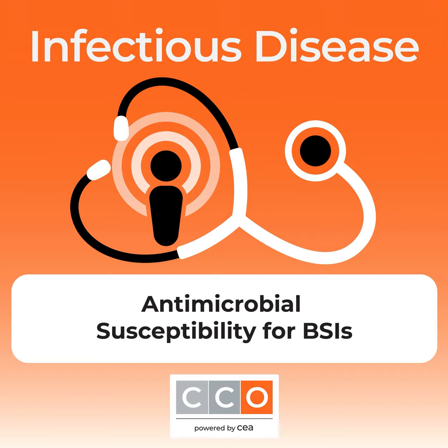Alexander. When we talk about antimicrobial stewardship for bloodstream infection and laboratory diagnostics, we see antimicrobial optimization in 2 different ways, escalation and de-escalation. What opportunity do we have? The implementation of these technologies is always beneficial, or you can obtain the most benefit, if you have an antimicrobial stewardship program that is able to intervene.